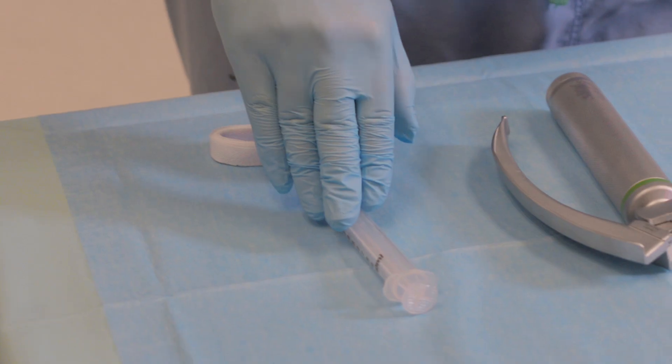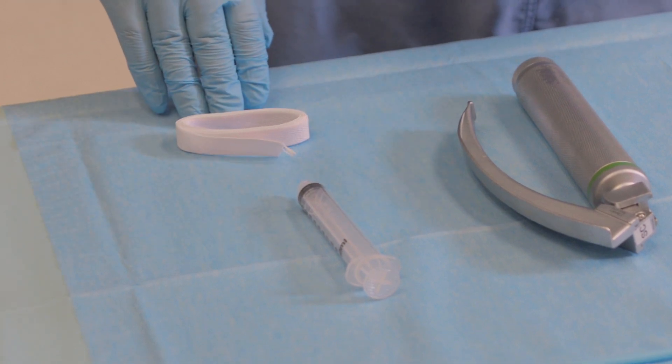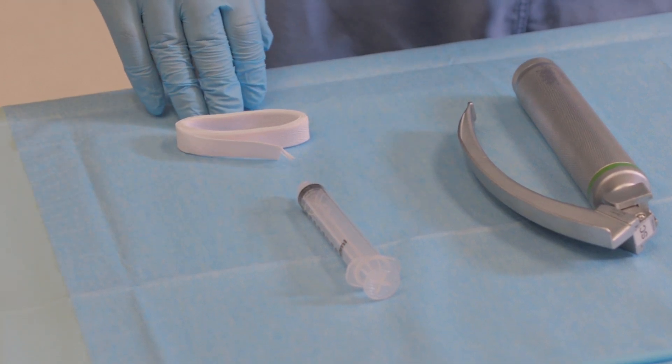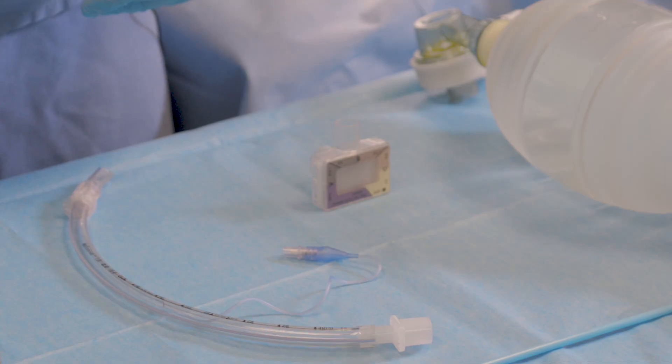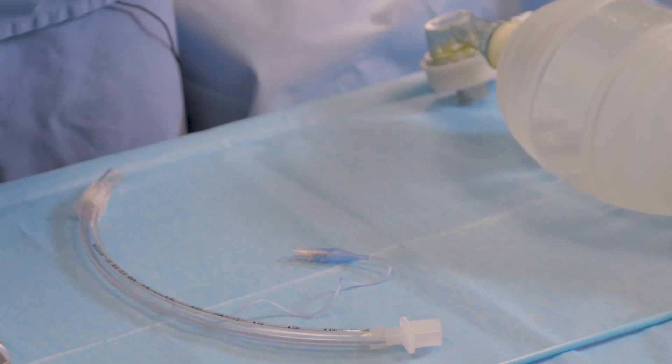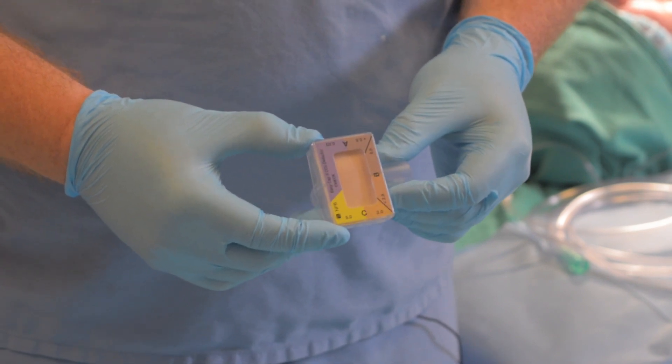We need a 10cc syringe to inflate the cuff of the endotracheal tube, and then some method — in this case a twill tie — of securing that endotracheal tube in place. Endotracheal tube placement should be confirmed with multiple different techniques, including continuous capnographic waveform monitoring, or, more commonly found in emergency departments, colorimetric CO2 detectors such as this.